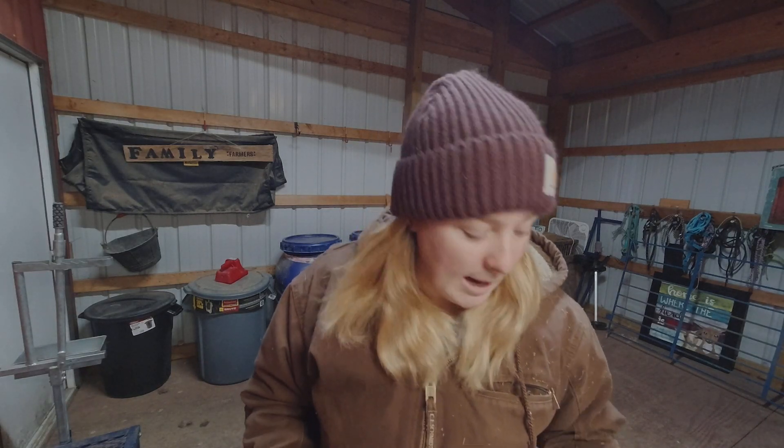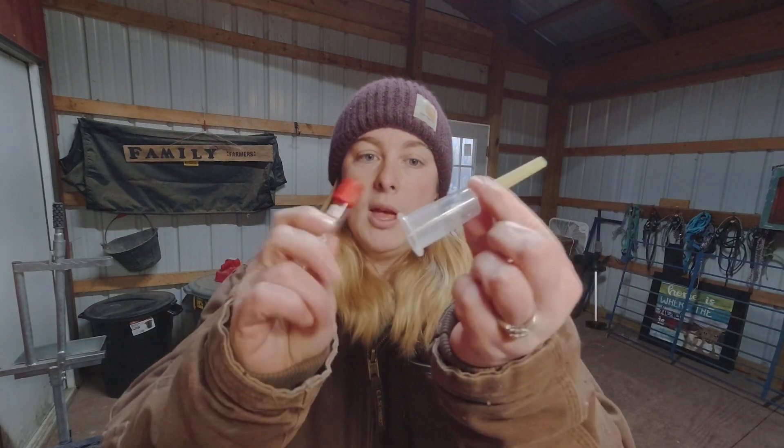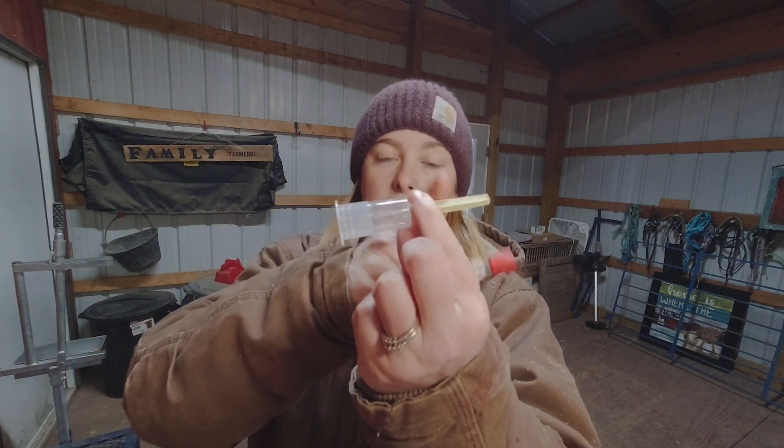The links will be Amazon affiliate links, which means I could get a small commission at no extra charge to you — but I want to make sure you have all those supplies at your fingertips after this video. I'm going to pull in two goats for you to watch: the first using a 6cc syringe paired with an 18-gauge needle, and the second using the red top tube with the needle holder and double-sided needle, so you can see how both methods go.